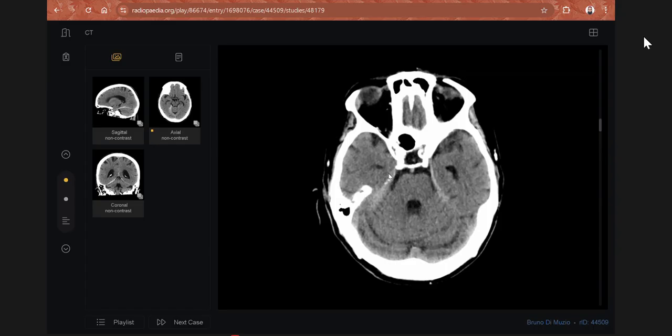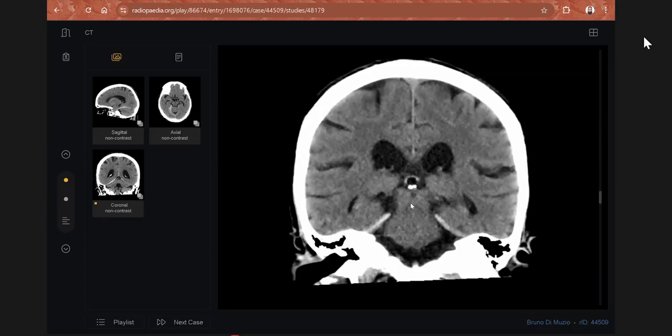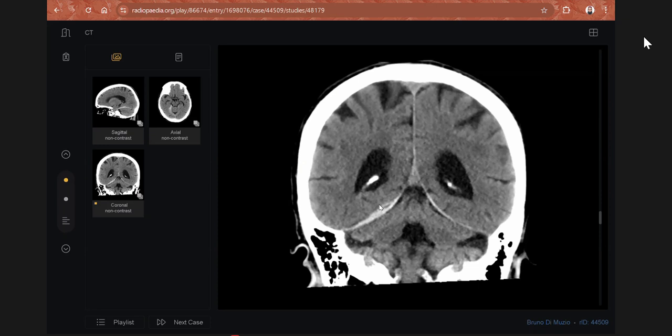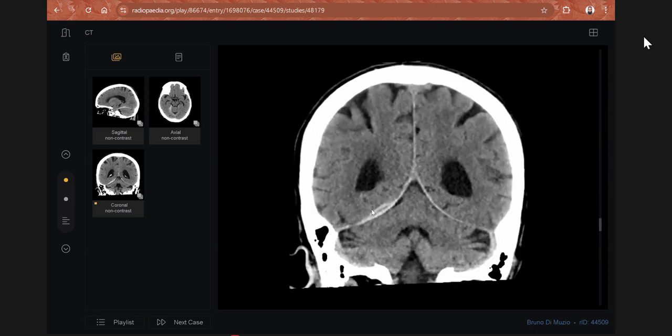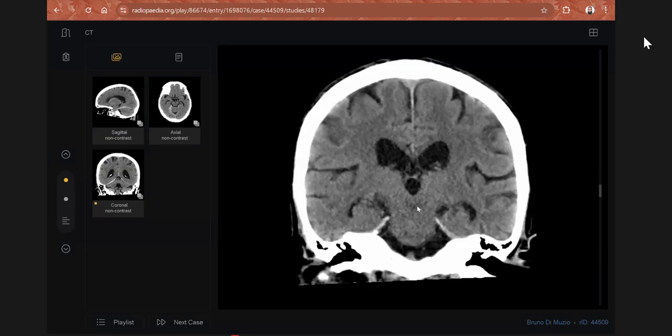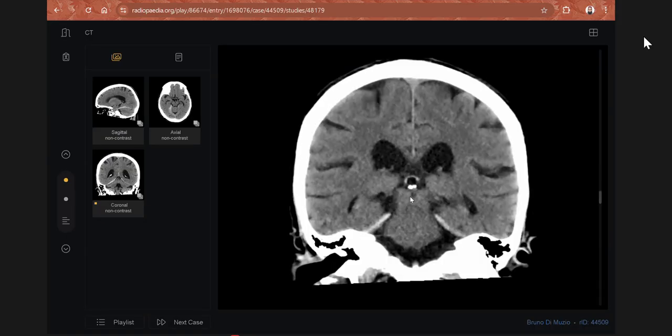Ask the examiner, I want to see coronal images. Okay, good, you picked the pathology on the coronal. This sliver of subdural acute bleed along the tentorium, right leaflet. So immediately inform the emergency team. In this case, this one is actually a small amount.